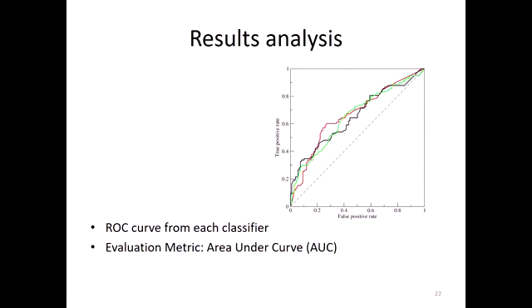Now, the autoencoder encodes the features, so there's no real way to decode them back. I've seen several papers that have gone through and said, well, here are all the models that we've tested, here are their metrics of goodness, the area under the curve, and then here's maybe the top 5, top 10 features that contributed to that model score. So we'd like to look at that as well.